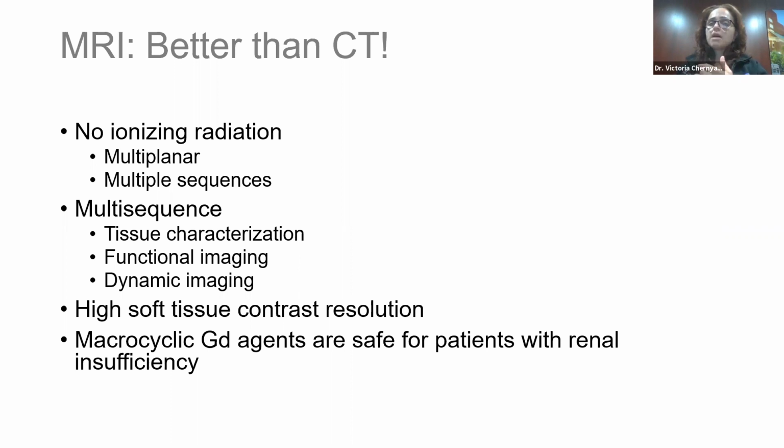So there's no damage to kidneys when we administer gadolinium, as opposed to iodine, which we use for CT. And because of these changes in guidelines, now we can administer gadolinium to patients with even severe renal insufficiency, including patients on dialysis. Another advantage of MR is that allergy to gadolinium is very, very uncommon. Allergy to iodine is not ubiquitous, but it's not uncommon. But true allergy to gadolinium is very uncommon.